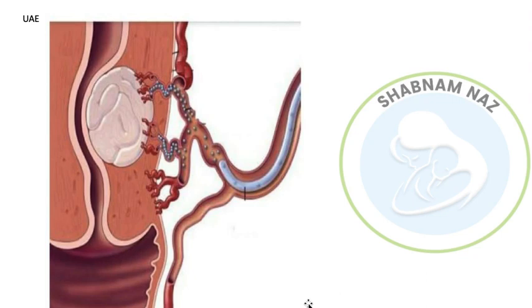Guys, this is a station on the uterine artery embolization, and this is a very common station for the exam. This is a picture which shows the uterine artery embolization. This is the catheter which is passed through a femoral artery to the uterine artery, and then the branching which supplies these fibroids, meaning feeding vessels which supply the fibroids. So these particles are the polyvinyl alcohol particles which are injected through this tube.